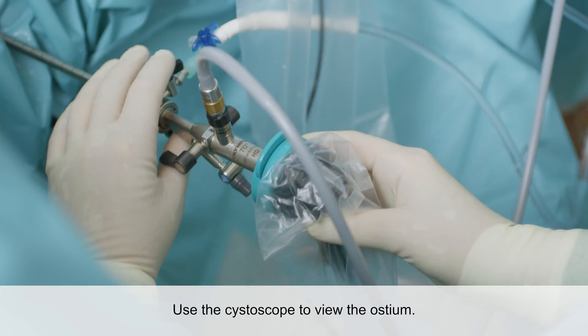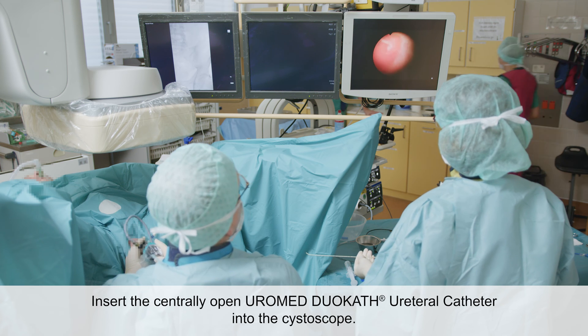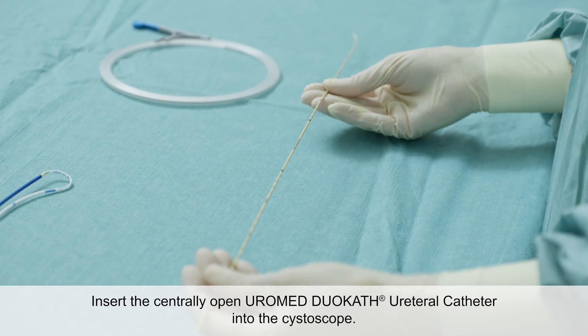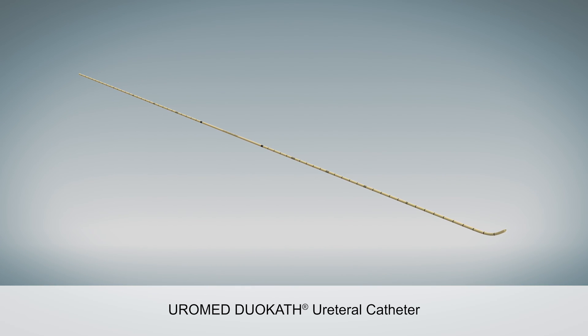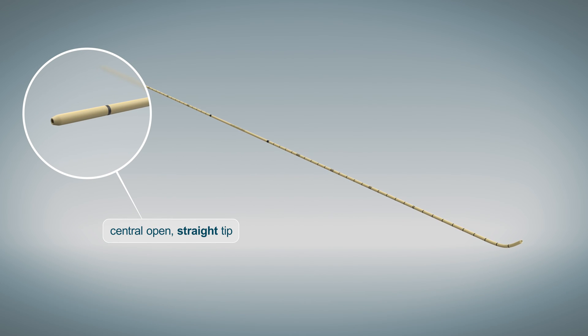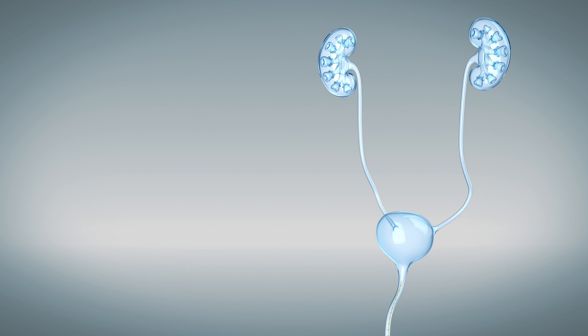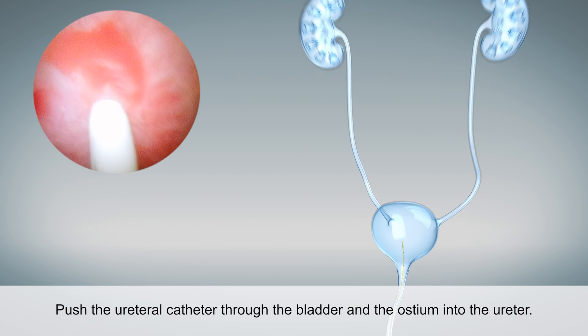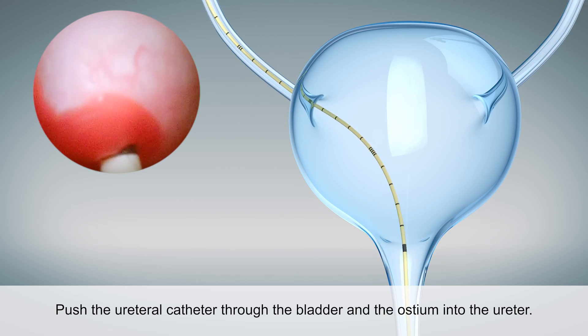First, the ostium is viewed via the cystoscope. The prepared Uromed Duocath ureteral catheter is inserted into the cystoscope. The catheter is equipped with two different tips. The ureteral catheter is pushed through the cystoscope into the bladder and from there through the ostium into the ureter.